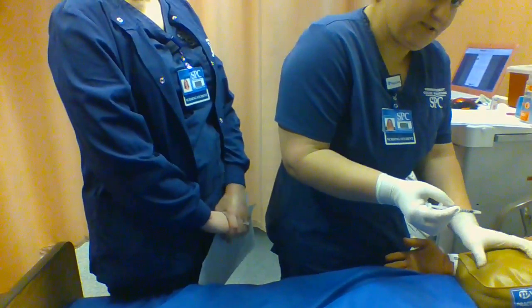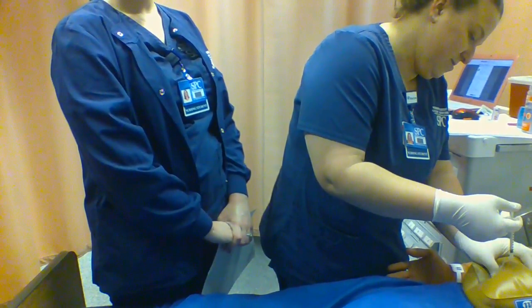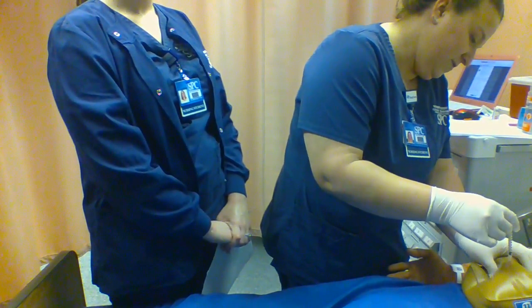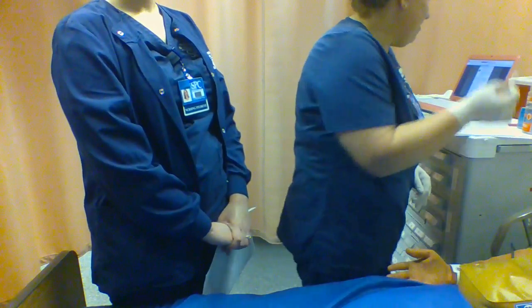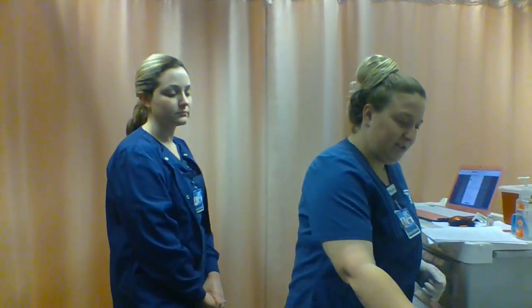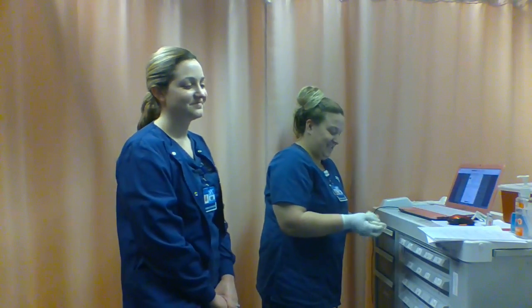Is that good? And I'm going to go ahead and pinch the side. Poke. At a 90-degree angle. Push the medication in. Hold for 5 seconds. Make sure it all gets absorbed. Pull out. On the sharps. All right. Very good, Ashley. It didn't even hurt a lick. Good. We'll be here.